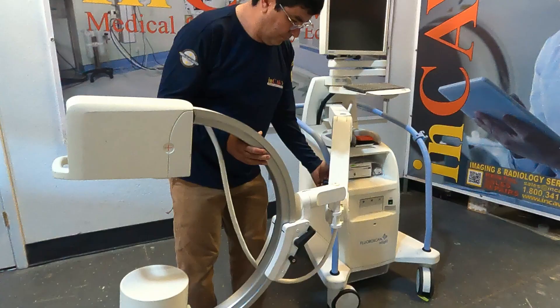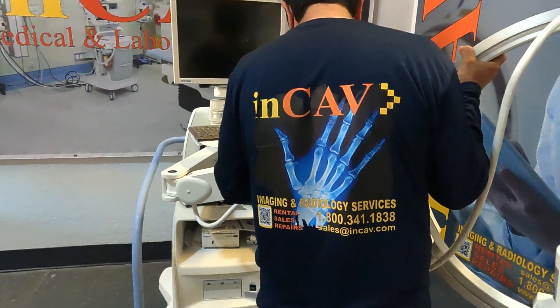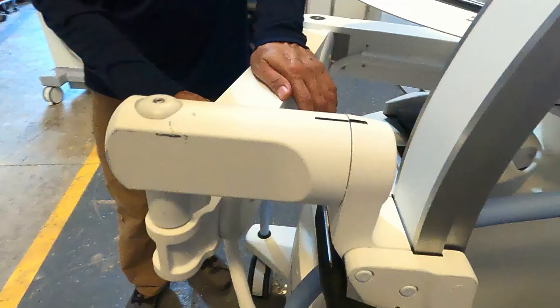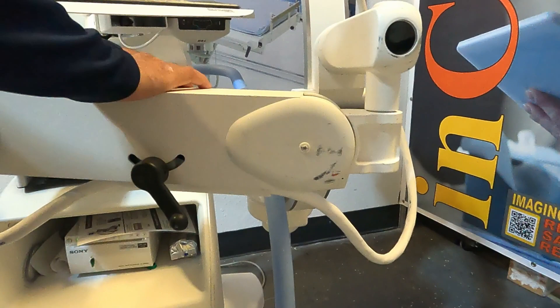Now we can put the Mini-C back in the transport or storage position. Put the C on lock — this is very important to protect the equipment. Remember to lock it so that it does not move.